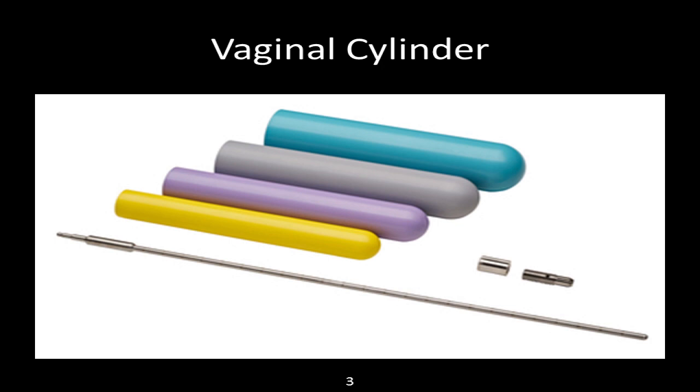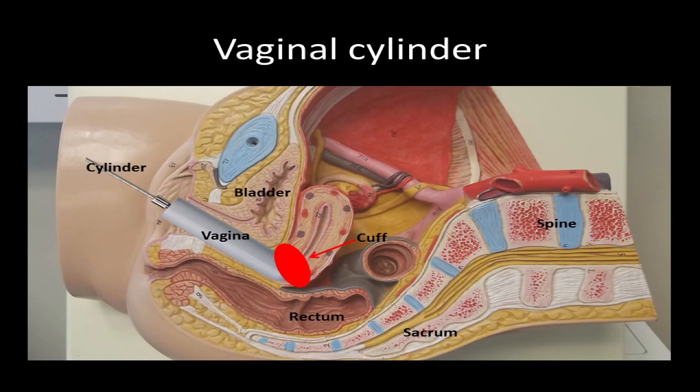For patients with endometrial cancer who require surgery and then require radiation, a simple cylinder can be used. Occasionally, needle supplementation is also used with this technique when appropriate. There are typically 3 treatments requiring device insertion for each treatment. Following the completion of each radiation treatment, the applicator is then removed.